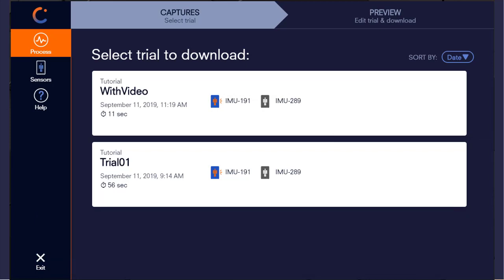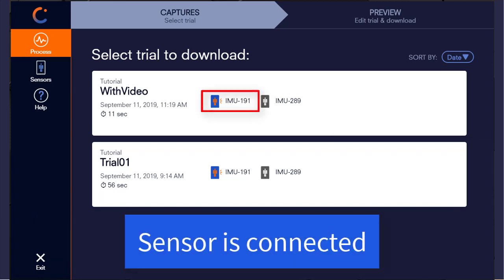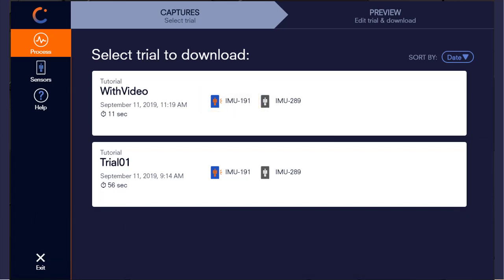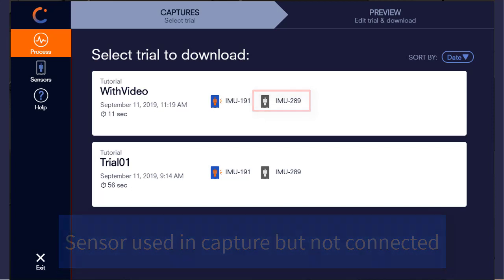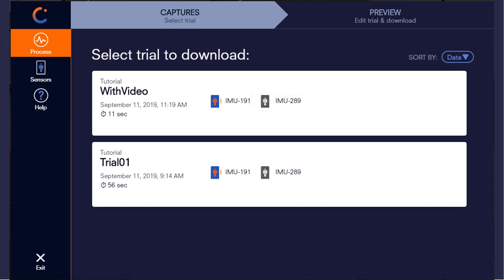If the sensor appears colored, it signifies that the sensor is currently connected. If it is gray, it signifies that the sensor was used in capture but is currently not connected to the PC.